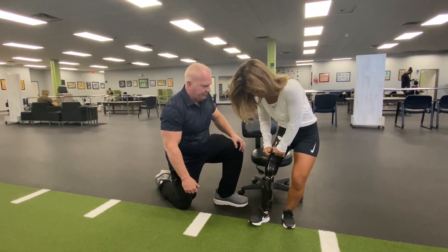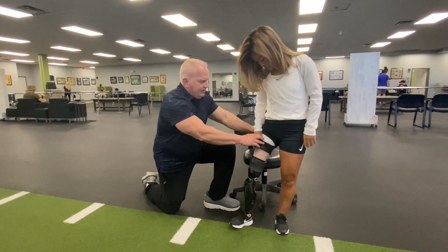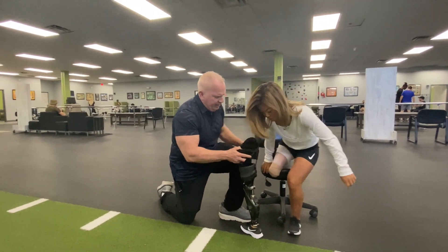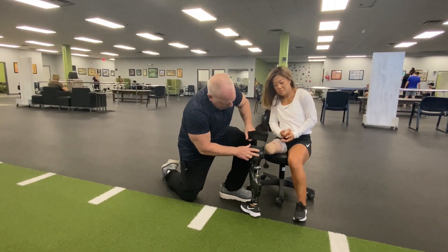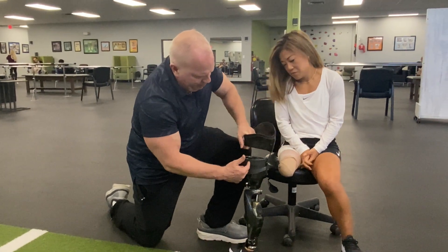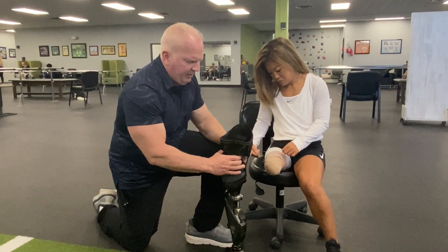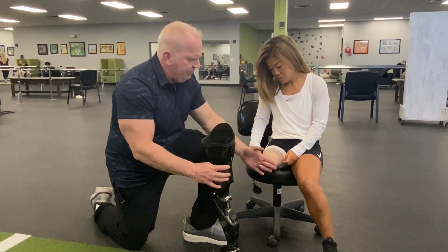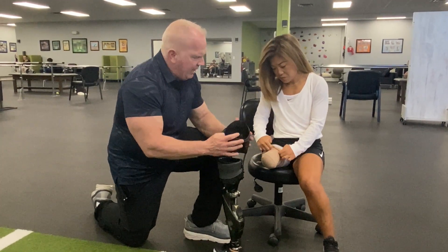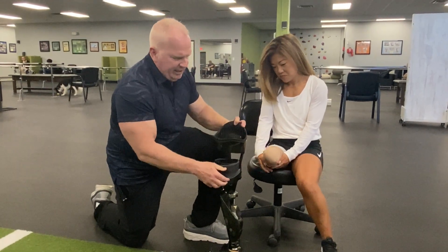This is the socket — go ahead and come on out of it. The way it works is the actual strut here has a bend in it, and when the person puts pressure as they have forward progression of the femur moving over it, this strut straightens up. It does two things: it allows the athlete to fire their quads and hamstrings. Scout can partially load here but she can't fully load at the bottom, so we've tightened her up mediolaterally to actually support her distal end.